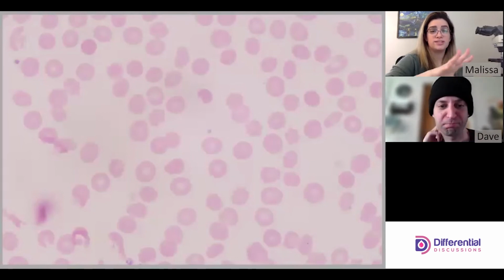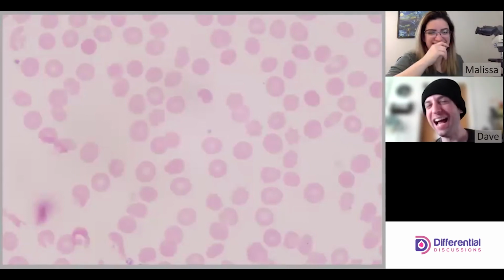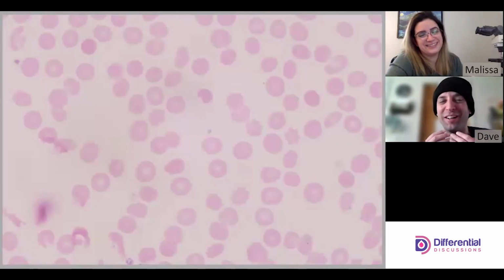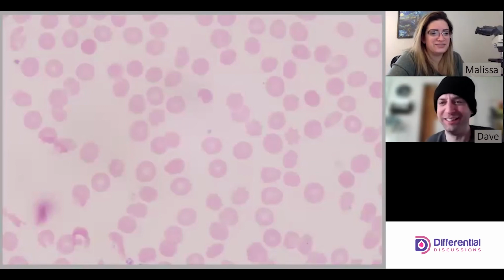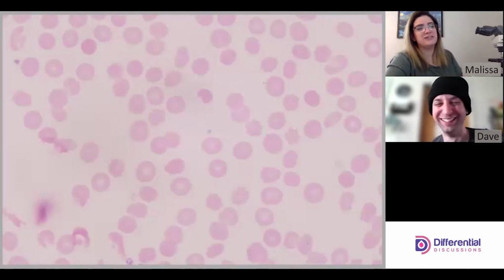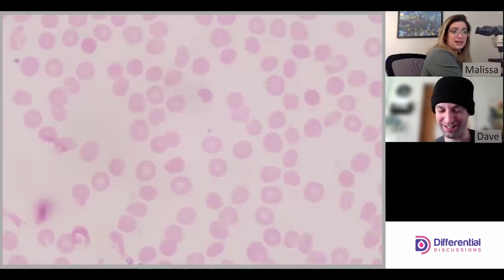Yeah, and you'll notice that Dave and I, I don't know if you were doing this or if I rubbed off on you, but we make the cells emote. They have emotion. Yeah. I think humans do that, right? Like we always impart a self on them that doesn't exist, but yeah, it helps us. You guys will see it more with white cells because we'll be like, ooh, this guy looks angry. But yeah, you guys will see it a lot more as we continue on. But I know what you mean by the cells look content. Yes. Yeah.